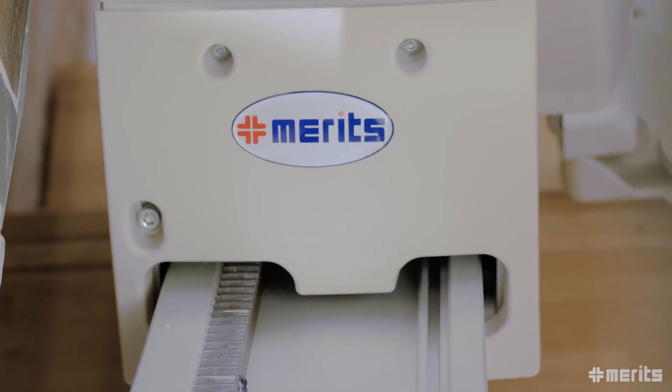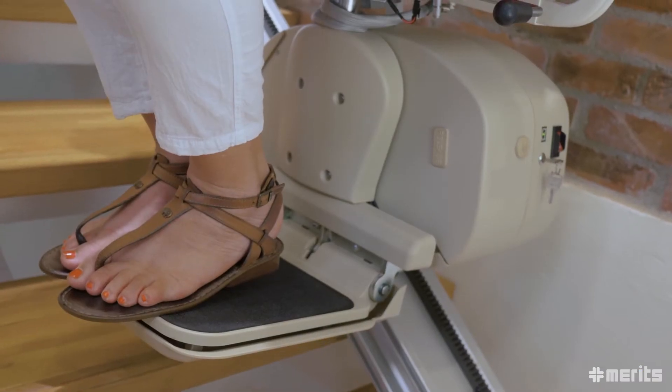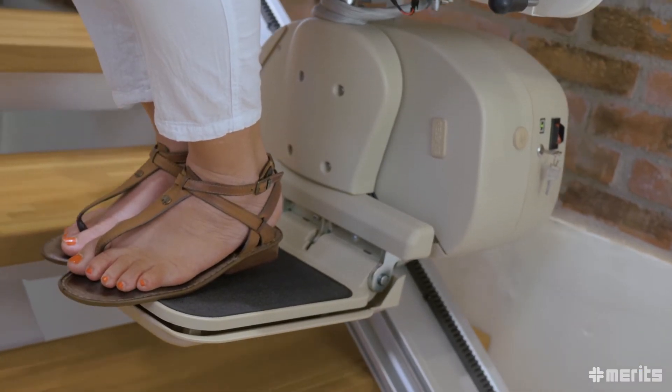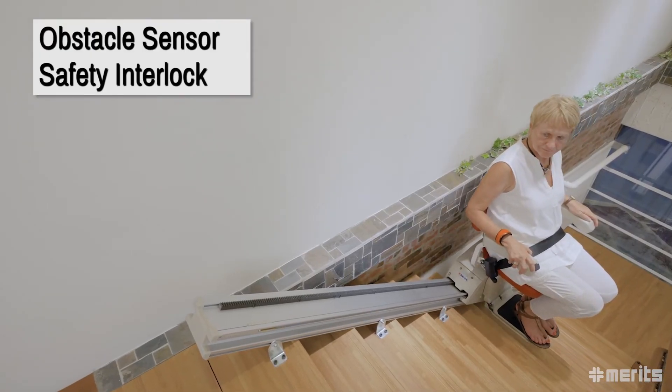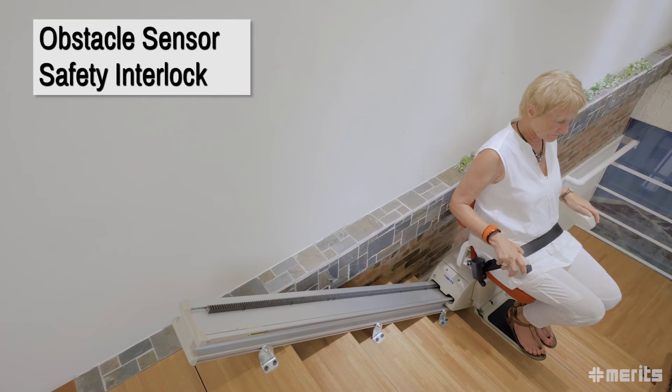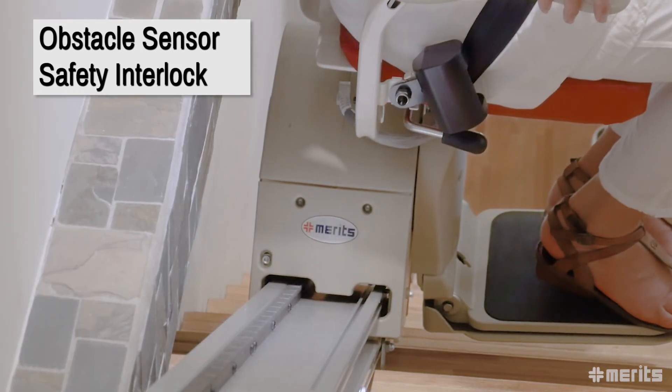It also incorporates Meritz's soft start and soft stop technology which ensures comfortable, no-lurch movement. Furthermore, the E603 features an obstacle sensor safety interlock which prevents the unit from colliding with any obstruction on the stairway.